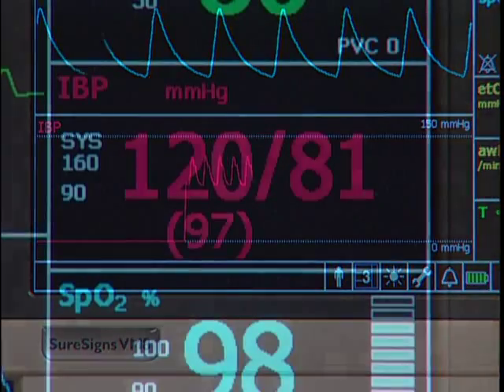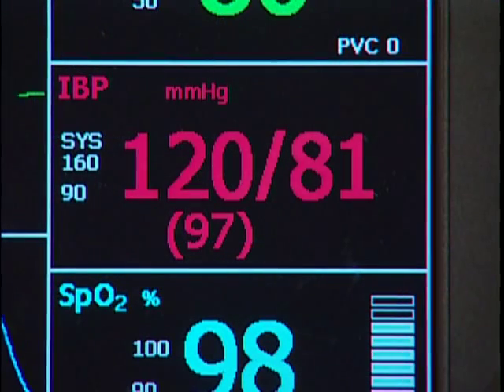The IBP waveform and the pressure numeric appear.